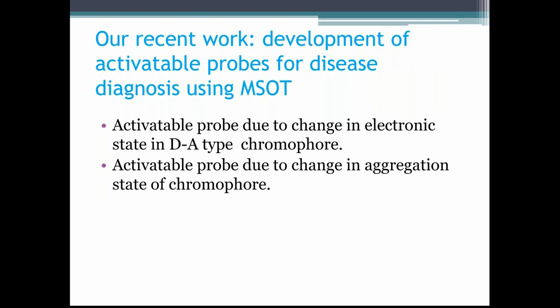Next, I will talk about two of our recent works involving development of activatable probes for disease diagnosis using MSOT. In the first work, the activatable MSOT signal is generated as a result of the change in electronic state in donor-acceptor type chromophore. And in the second work, the activatable MSOT signal actually results from the change in aggregation state of the chromophore.